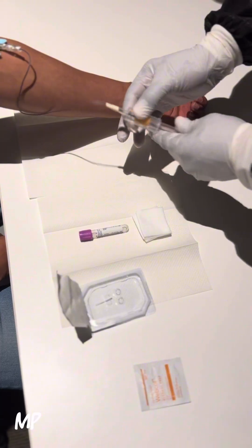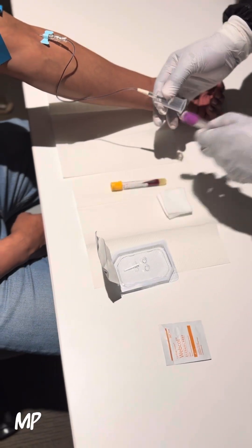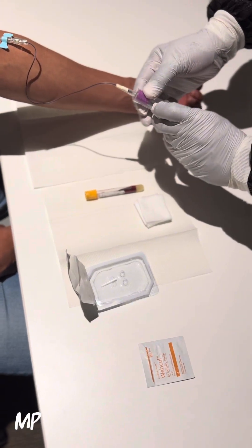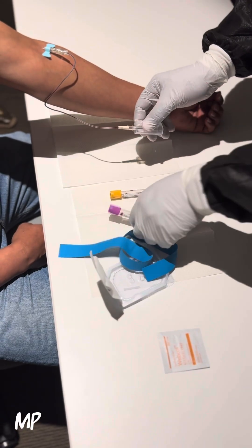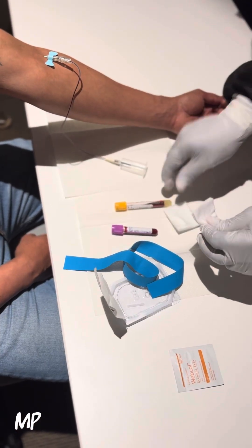We won't take too much. Multiple draw. Release the tourniquet, twist and pull off the tube, place down your vacutainer holder.